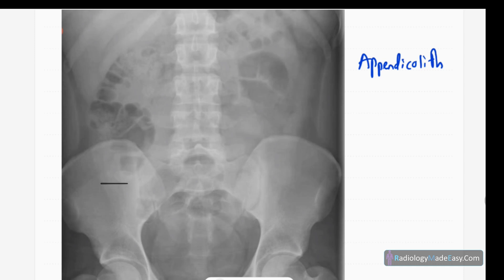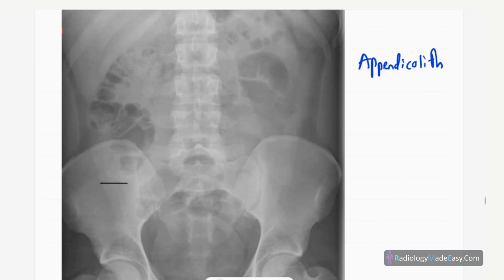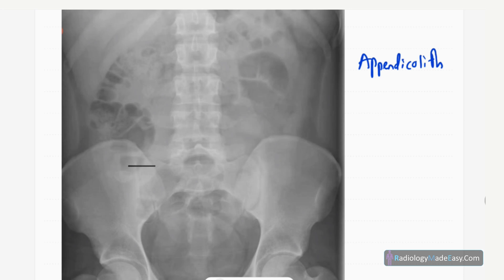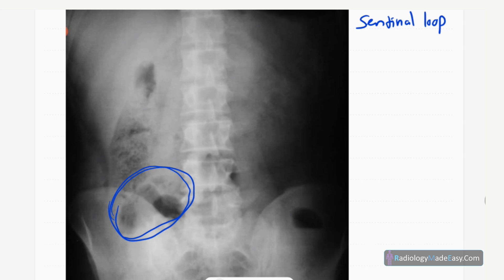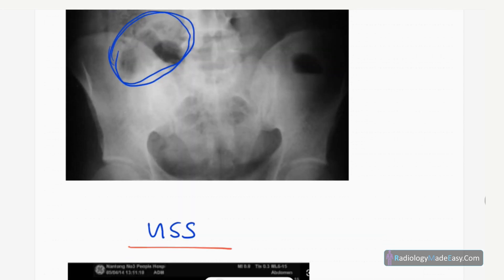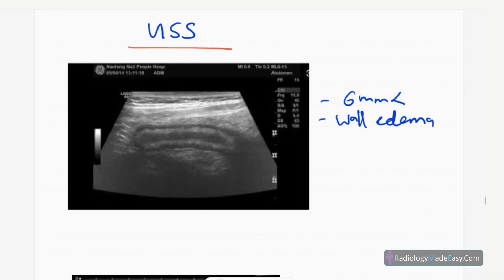In another abdominal X-ray, you can see a locally dilated small bowel loop called a sentinel loop. The cause is inflammation of the appendix producing this localized dilatation of the small bowel, which is an adynamic loop. This dilatation indicates inflammation in the adjacent bowel and can also occur in acute pancreatitis. It represents the sentinel loop sign — local dilatation of the bowel loop in the inflamed area.